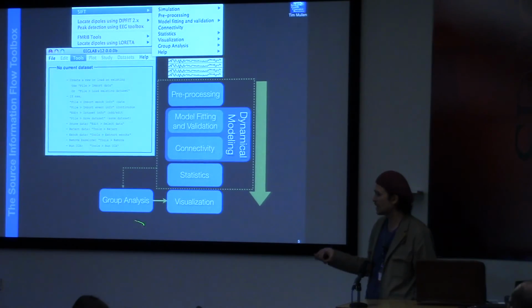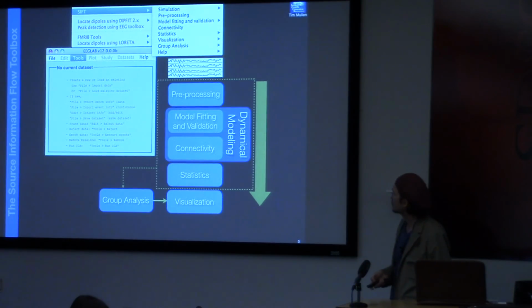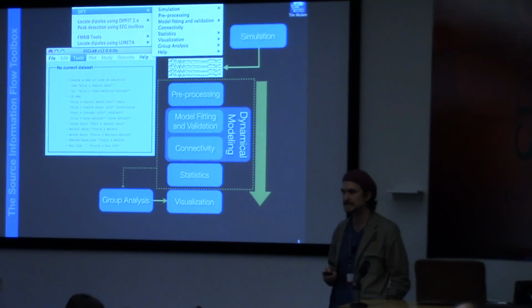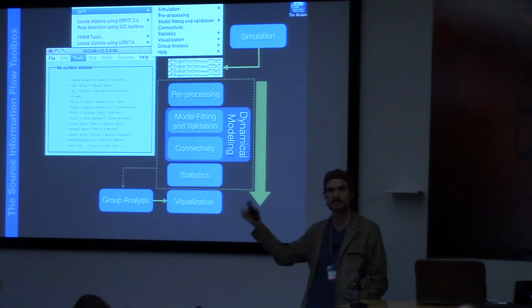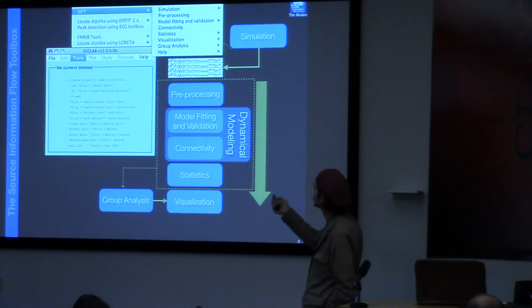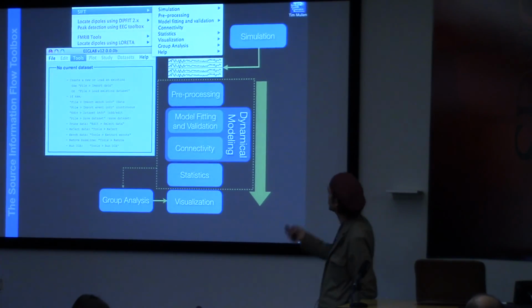There's also a component of routines for group analysis, hierarchical Bayesian modeling and such. We'll cover a little bit of that. And there's a simulation module that allows you to build sophisticated, reasonably realistic dynamical models of neural activity, project them to the scalp, and build basically simulated EEG data under a very wide array of different kinds of network assumptions.